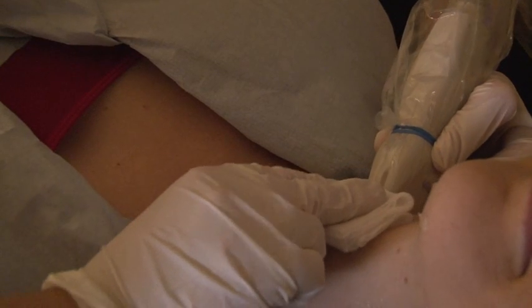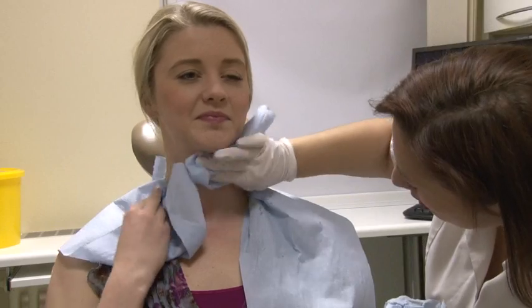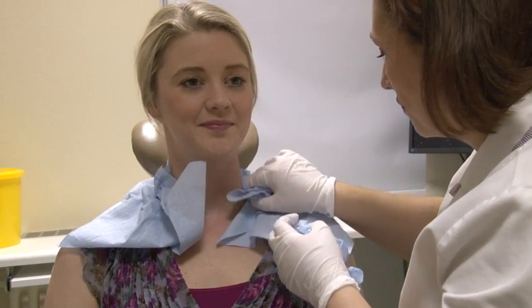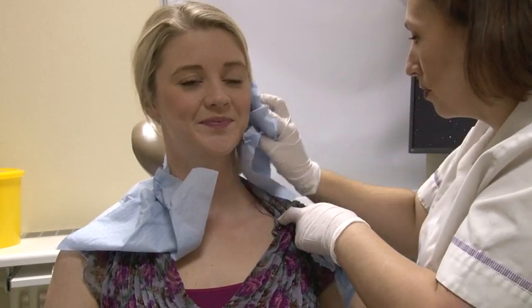The procedure itself takes a few minutes to carry out. Afterwards, the biopsy site will be cleaned. A dressing or plaster is not normally needed. Occasionally, a bruise may develop at the biopsy site but there are generally very few complications. The results of the scan and biopsy will be sent to the doctor or dentist who referred you, which may take up to two weeks.